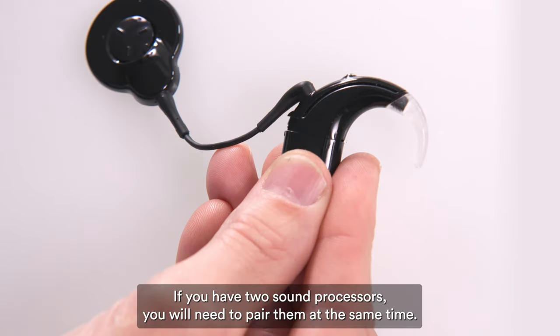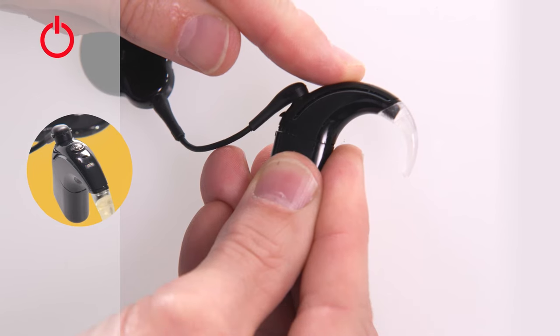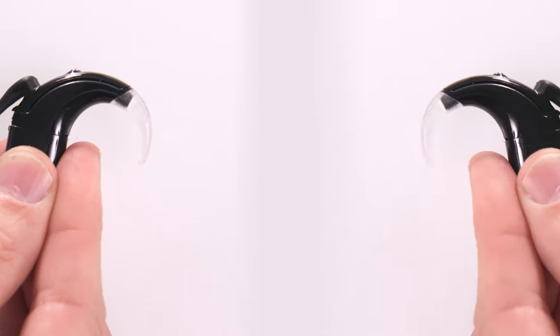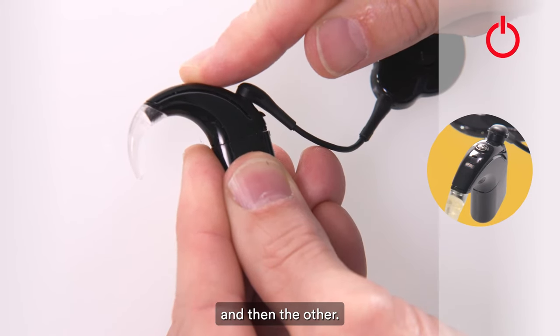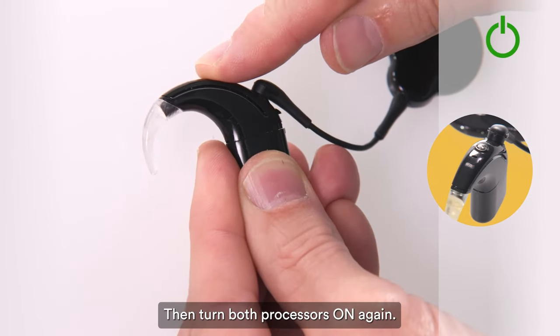If you have two sound processors, you will need to pair them at the same time. To start the pairing process, turn off one sound processor, and then the other.